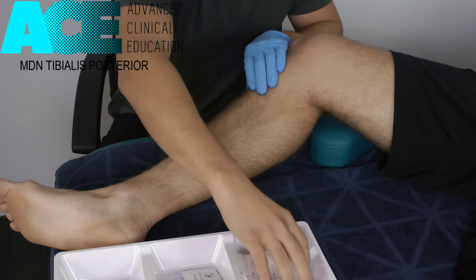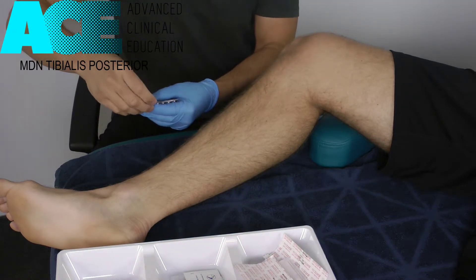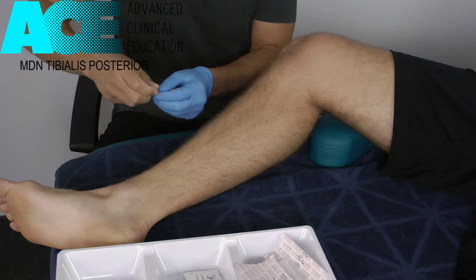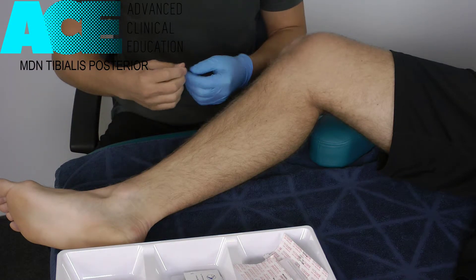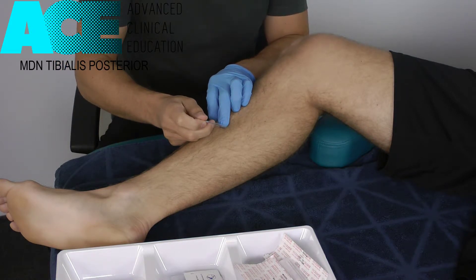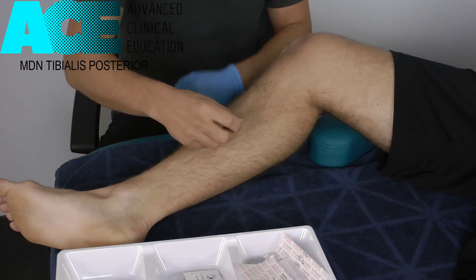I'm just going to swab that down to make sure it's clean. You can use Red Coral or Myotech needles. You don't need a long needle — I've got a 40mm needle in this case, which should give us enough access behind that bone to access the trigger points. We're going to come about a centimetre or two away from the medial edge of the tibia and angle the needle back posteriorly behind the bone.